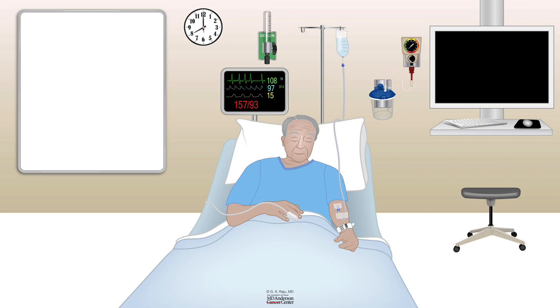Coming to the complications of EUS, one complication is perforation. This tends to happen when there is an esophageal cancer that looks obstructed, and then we try to push this endoscope through. It can result in perforation. It's important to keep in mind the outer diameter of an echoendoscope is much larger than a regular EGD scope and also much stiffer.